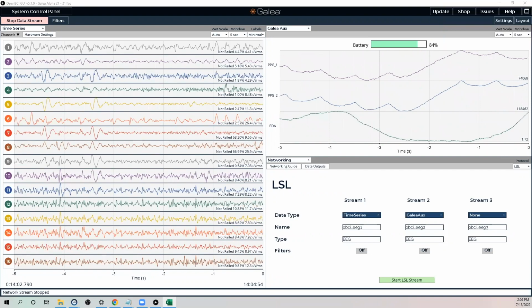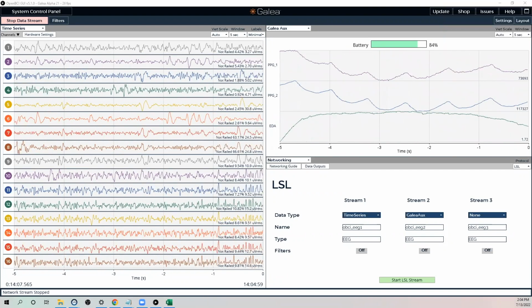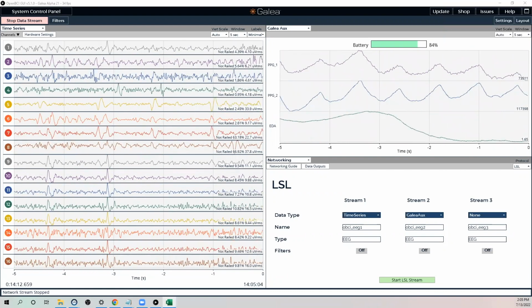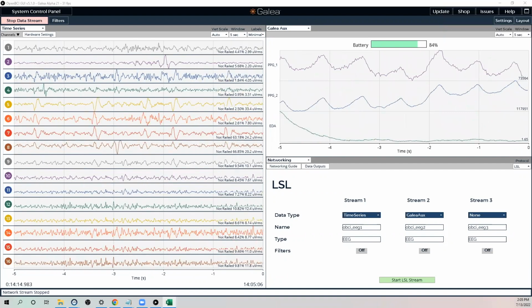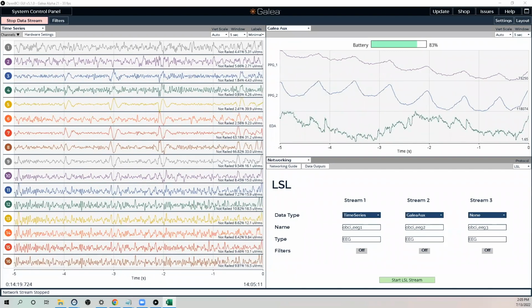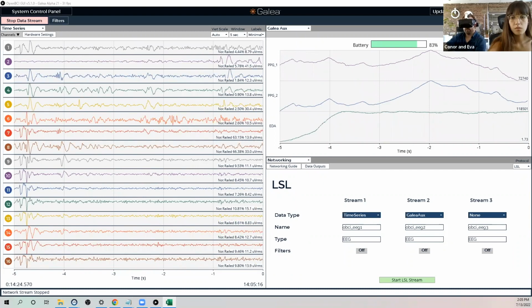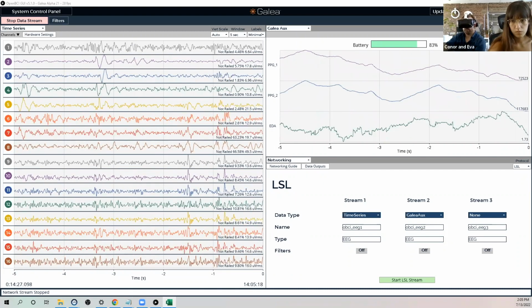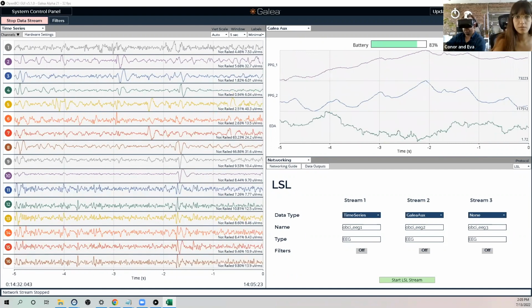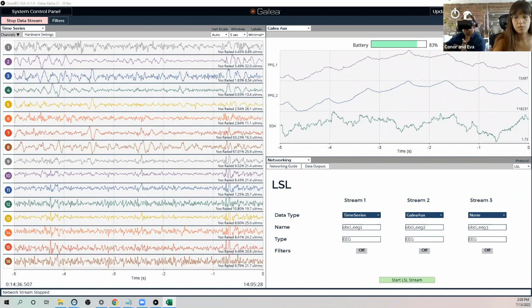How do you anticipate dealing with interference or EMF, RF bias from attachments, the environment, high bandwidth wireless modules or cooling fans that may be in operation around the device, and also the eye tracking itself? This is a good question, and right now, we've designed the Galea add-on to be electrically isolated from the headset itself. So that's part of the reason why we're not pulling any power off of the headset, and the Galea system is battery powered and electrically isolated.